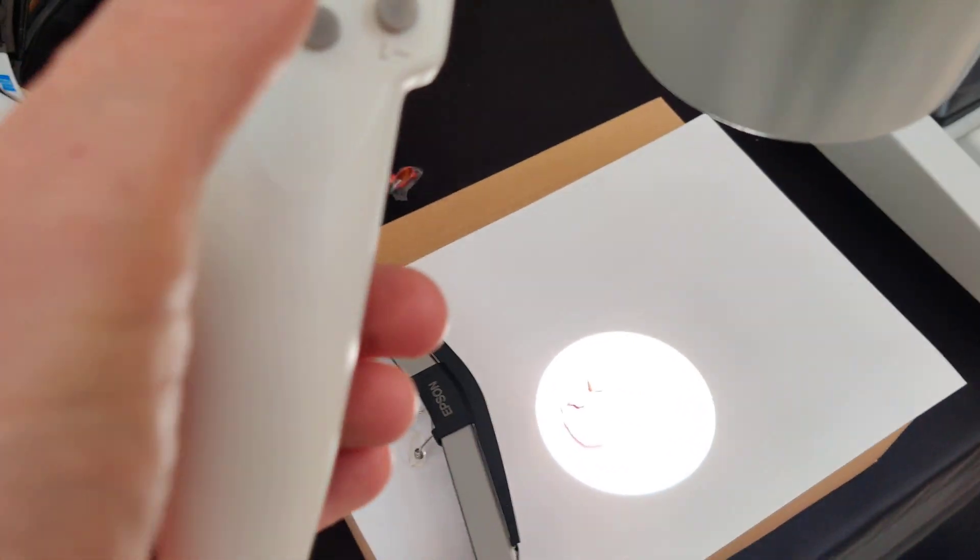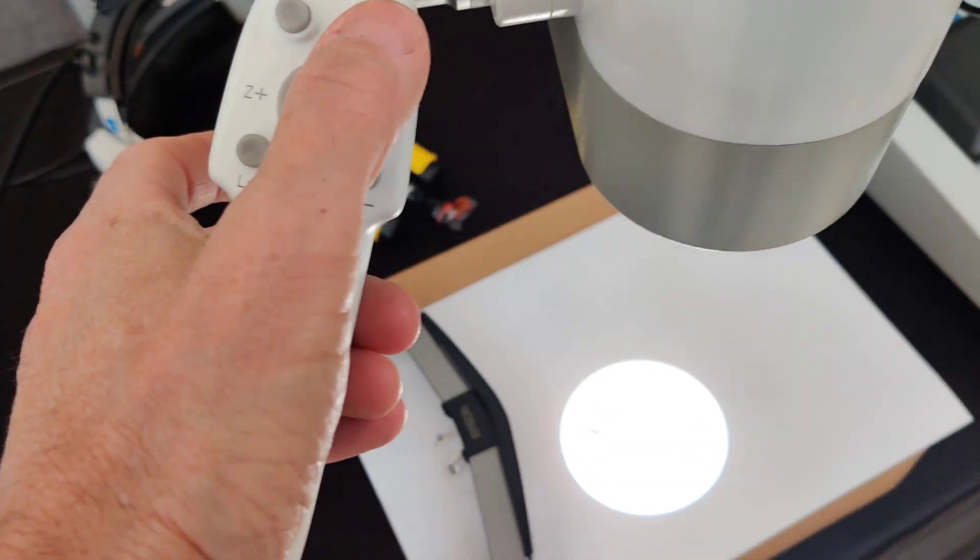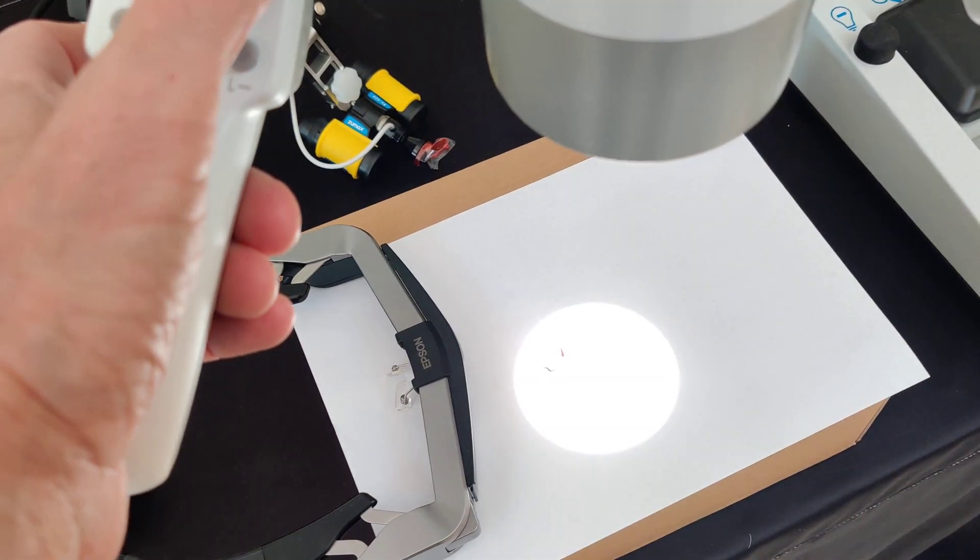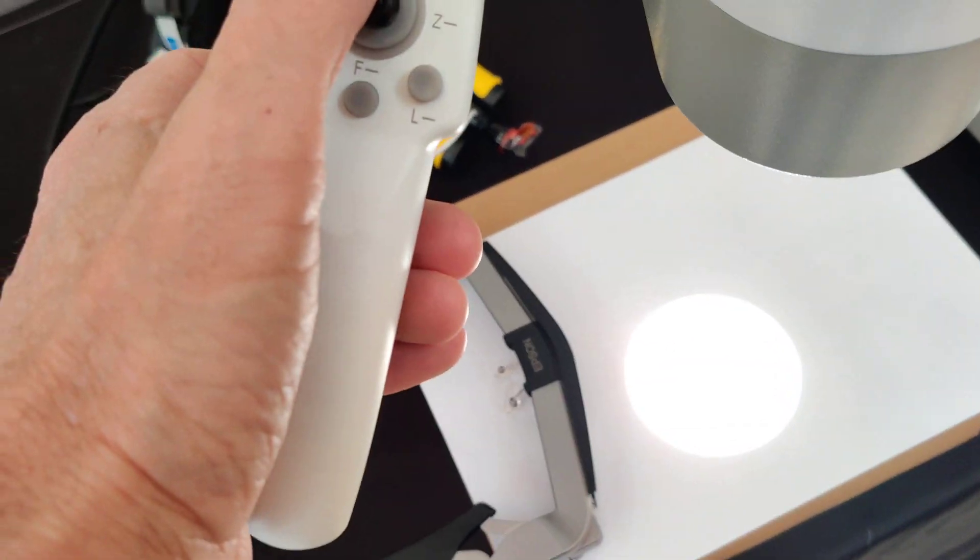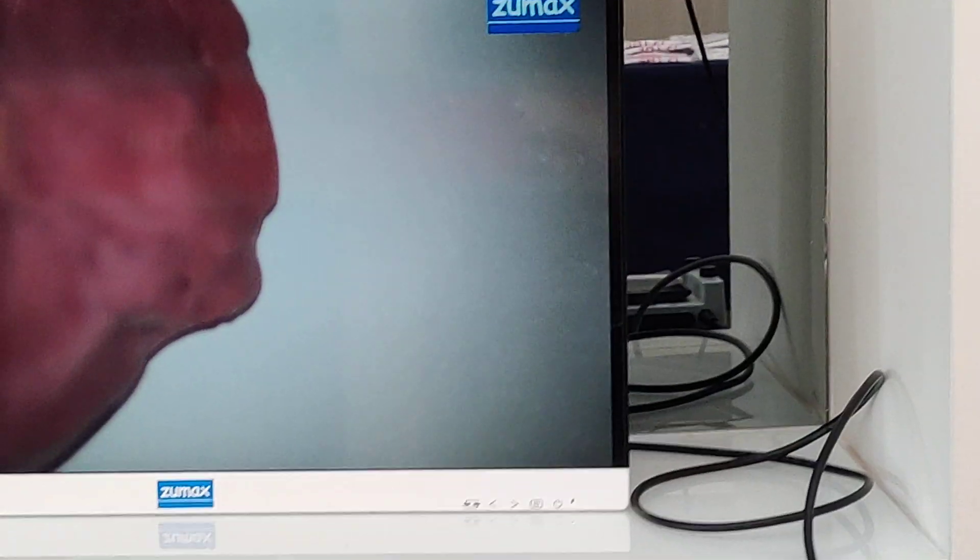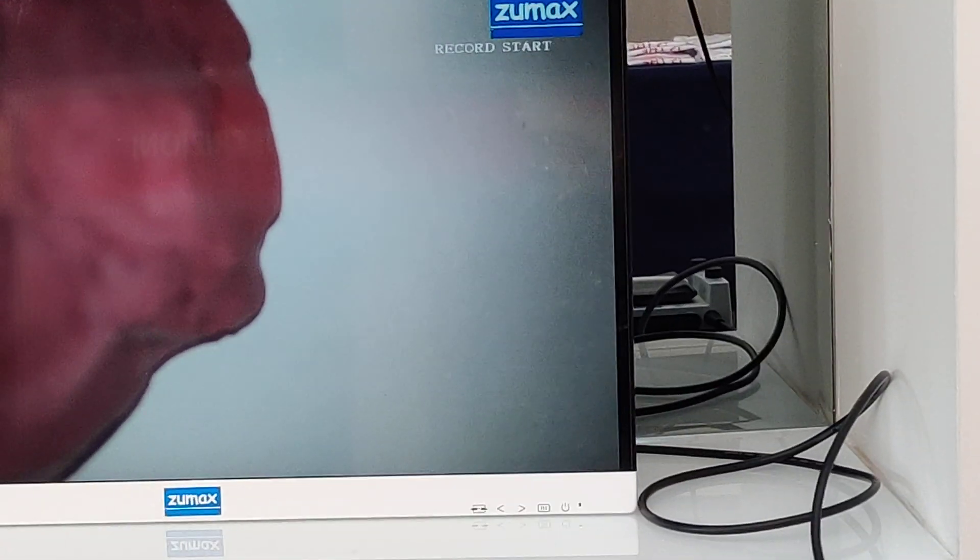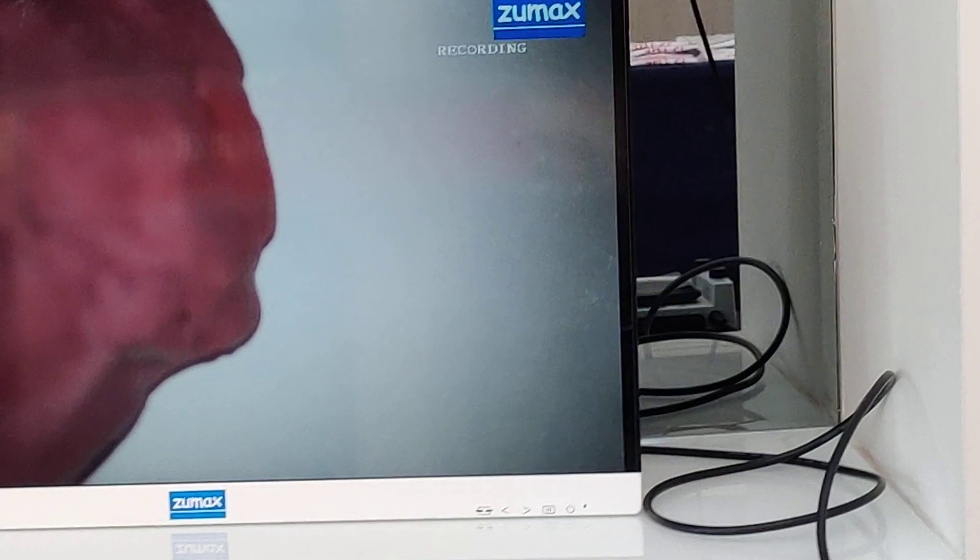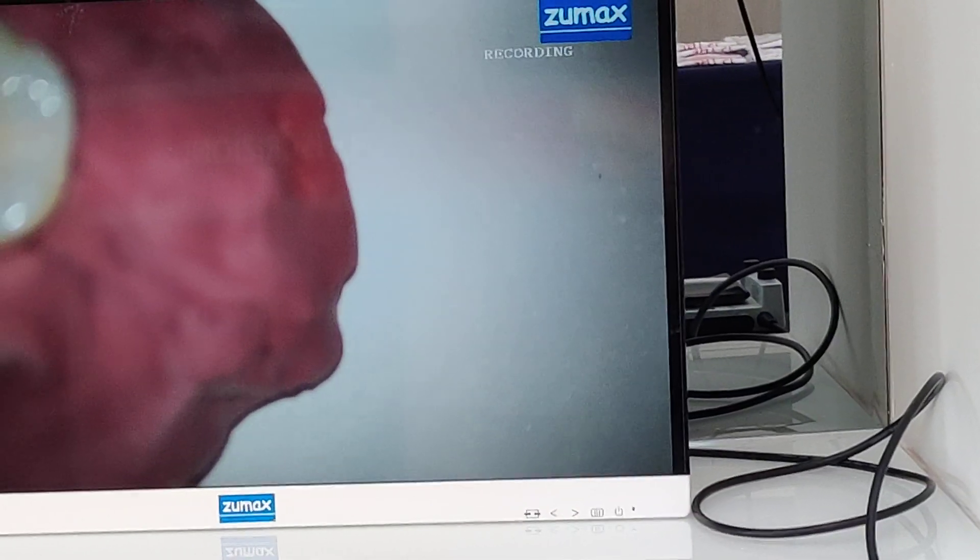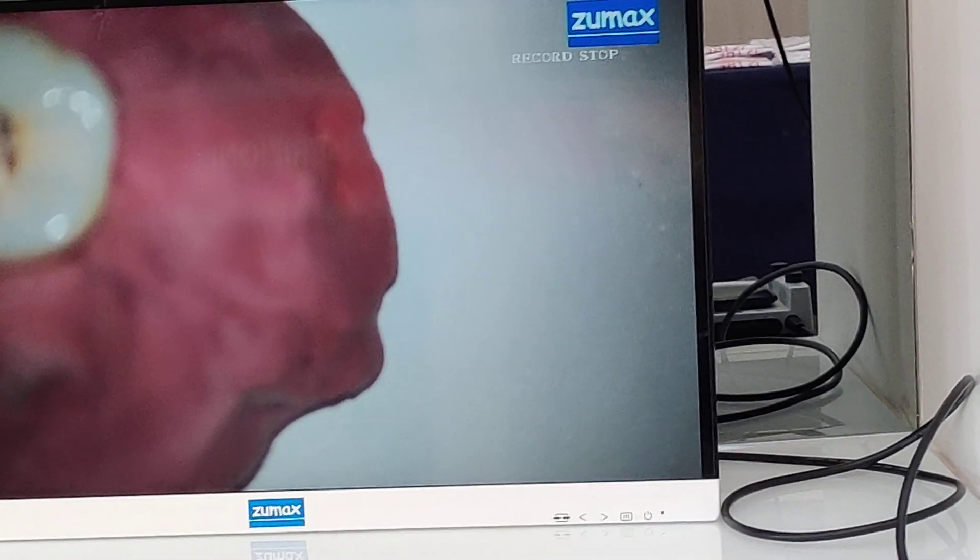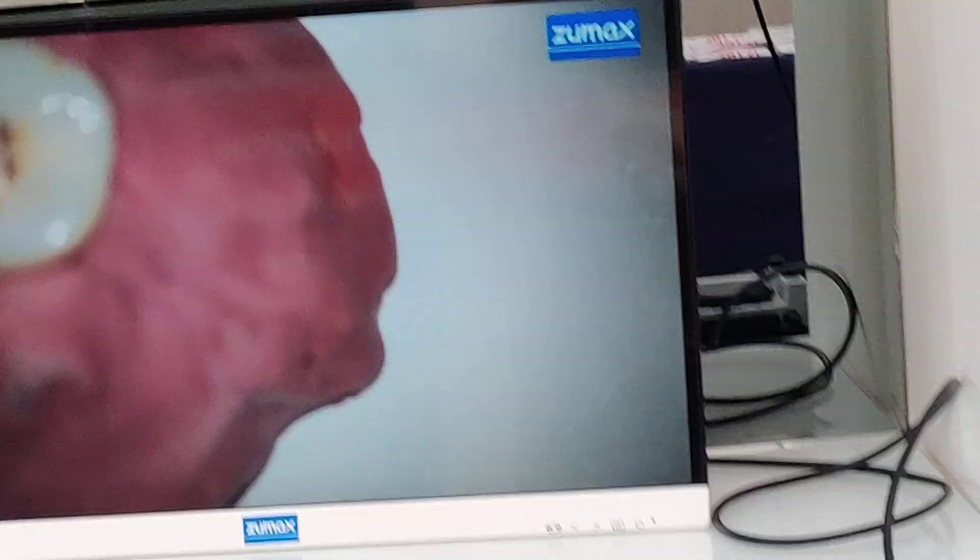Let's start from the LED turning on and off, and turning on picture here. Let's make some zoom. We push shortly and we take a picture. We push long, the recording is starting. We push short, we take a picture as well. We push long, the record is stopping.